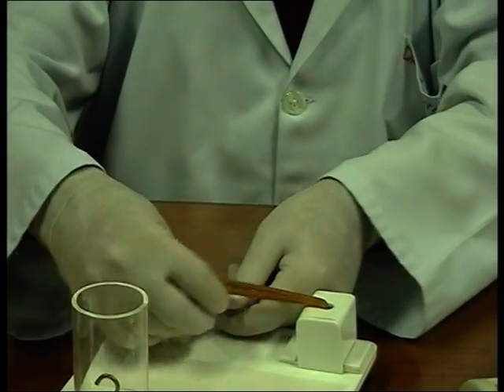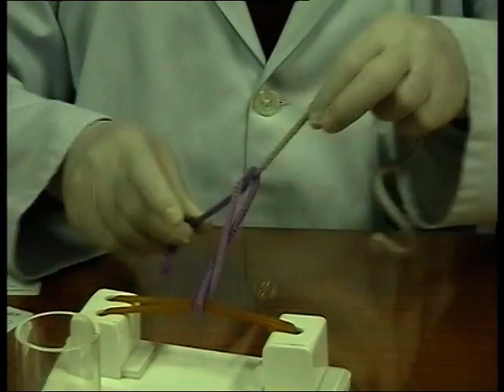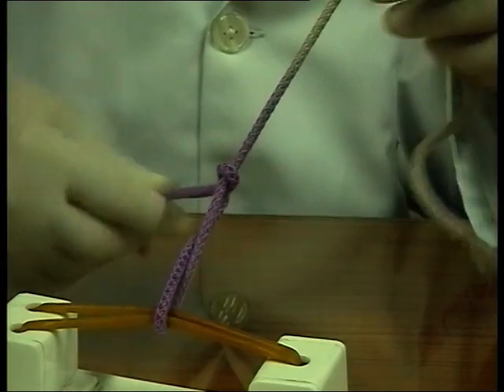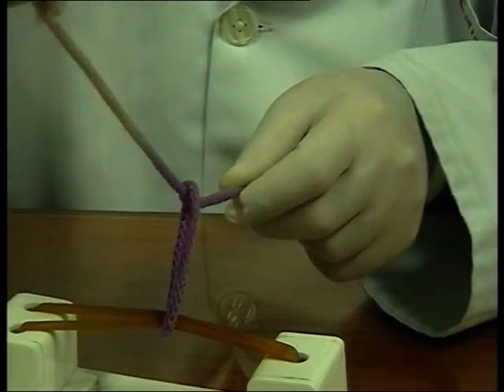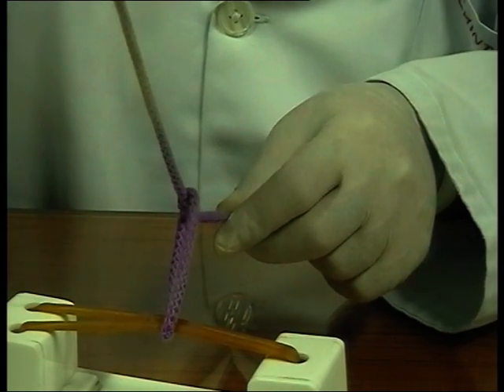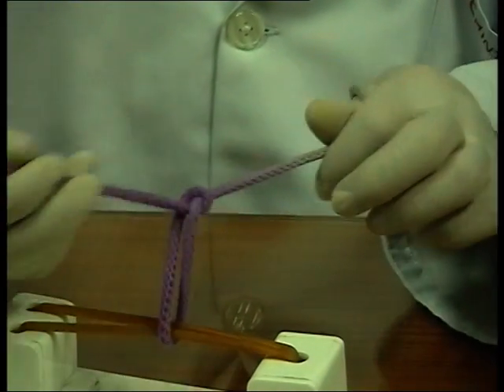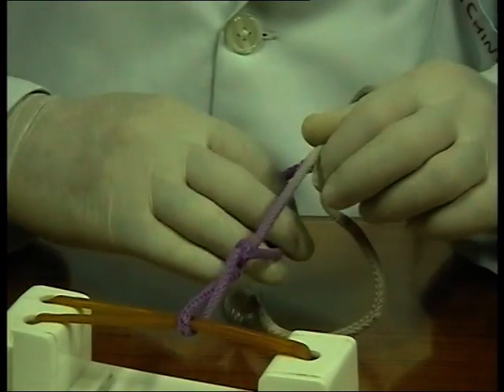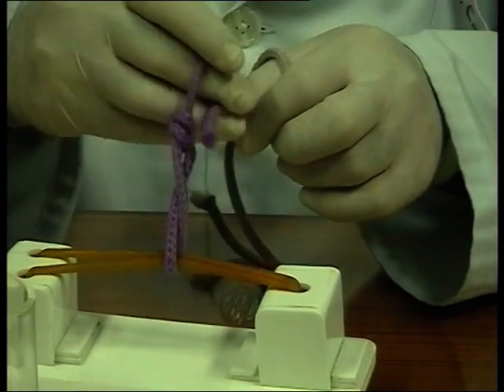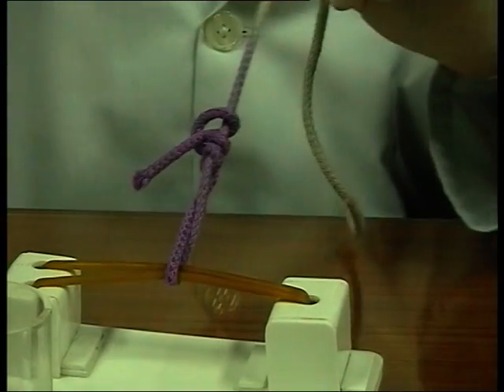Reason being, I'm repeating, keep it zoomed please. This is crossing without a throw. The moment you see this, your knot is wrong. Some people do the wrong knot and then they correct it. It becomes a reef throw. But then that's first going the wrong way, then correcting yourself. There's no point. Otherwise, this is a mistake. You can see I've crossed. I'll keep on putting. Doesn't matter how many I put, they're all slip throws. Just merely slip throws. They are not going to be any good.